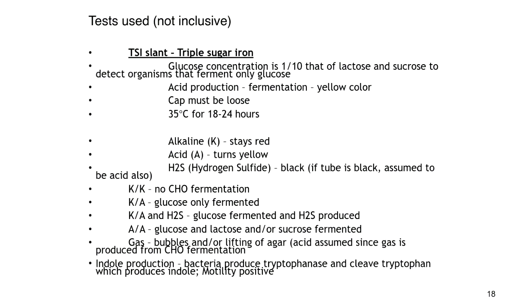But I would say the only test item on this slide is what TSI stands for: triple sugar iron slant, and it's used for enterics because of all the fermentation that happens. If you think about what the gut is, it's a fermenting kind of area. So know what a TSI, triple sugar iron slant, is.